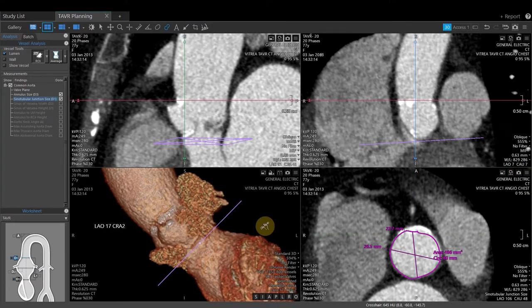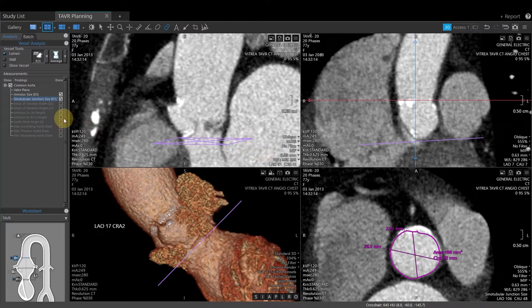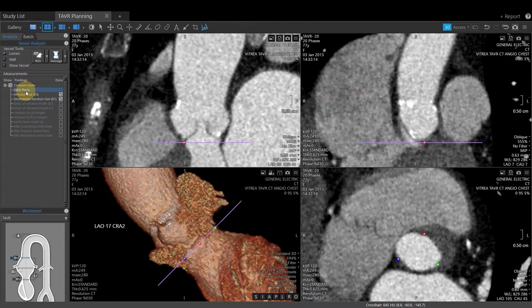Note that since the images have been obliqued on the MPRs, we no longer have a single purple line. To reset back to valve plane, click back on the valve plane measurement in the measurement list, then proceed to the next measurement.